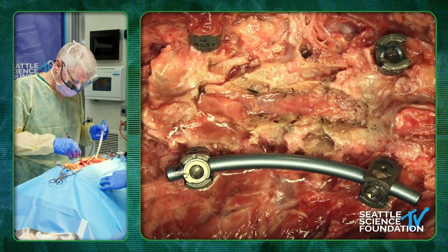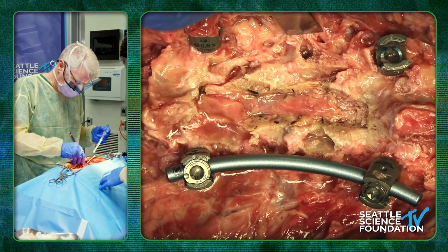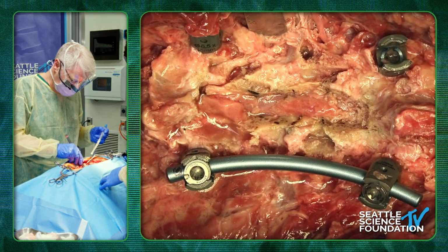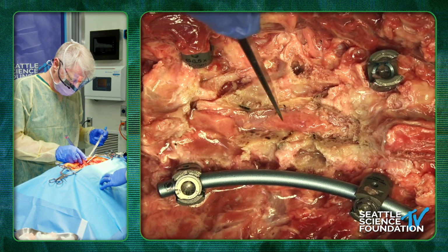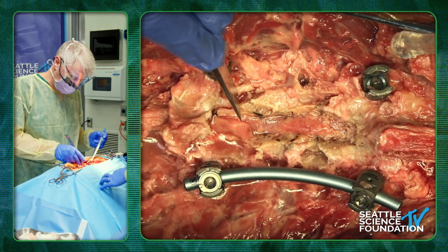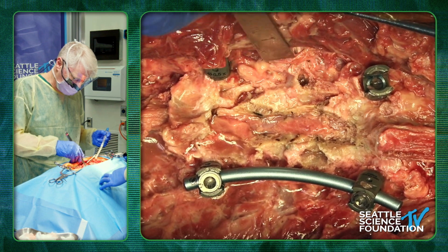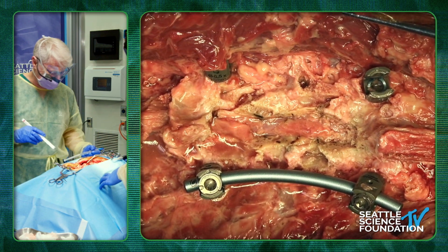So we have the pedicle with the hole from the previous screw, and we're going to separate it from all its bony attachments. The lateral bony attachment is the transverse process, the proximal end is the superior facet, and the bottom part is the pars. As soon as he gets rid of the pars, the inferior facet will fall off, and that's the first step we're going to do now, isolate the pedicle. Do you want to cut the transverse process?